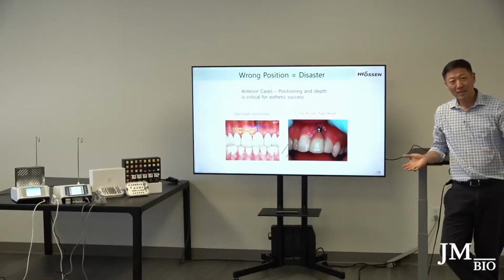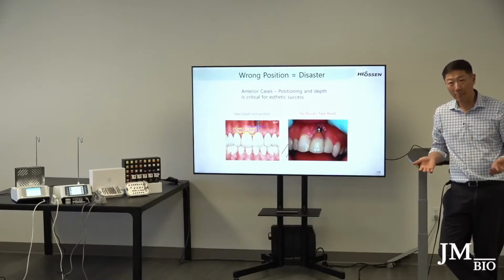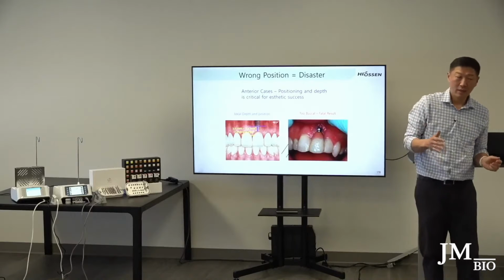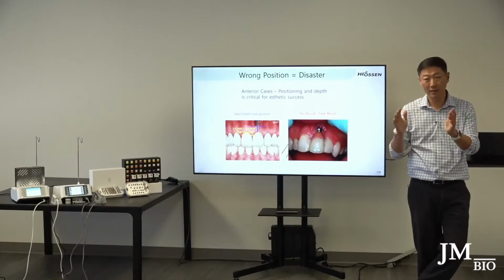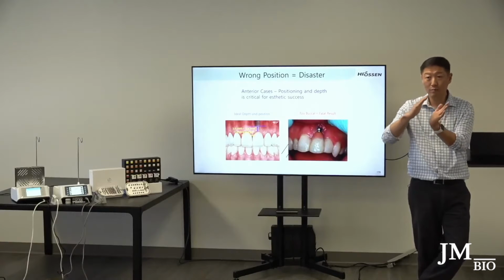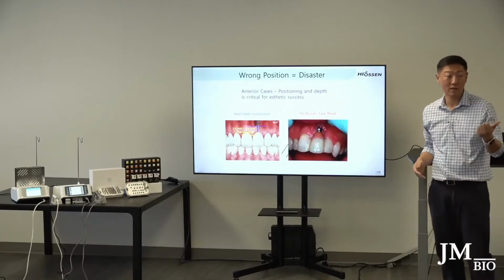So once again, back to the doctors, right? It's us ultimately that's responsible to accept and approve the case. Remember, a lot of times the technicians, I'm not trying to badmouth anybody, are just looking at the bone. Sometimes they're not looking at it from the tooth. And so the implant, the way it was planned, was positioned way buccal because the bone, the ridge, was like this. But it should have been planned more like this, and they didn't plan it like that. She just approved the case and did the case.